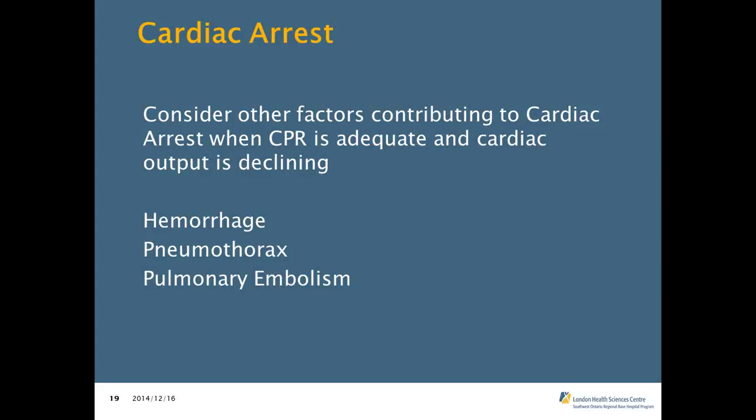So, you know, for prolonged periods of downtime, the cells are going to stop working, they're going to stop producing CO2, so you're going to have a low end-tidal CO2 reading. So when you have multiple things going on, capnography is not as clean as when you just have one single thing going on. And as we know from our patient populations, the majority of these patients have multiple issues occurring.